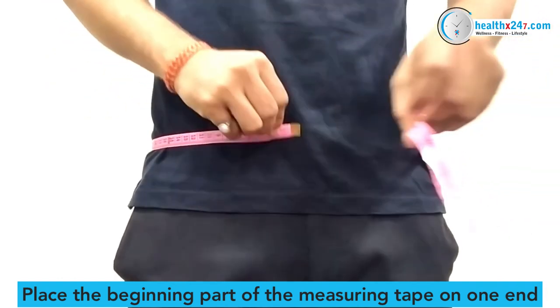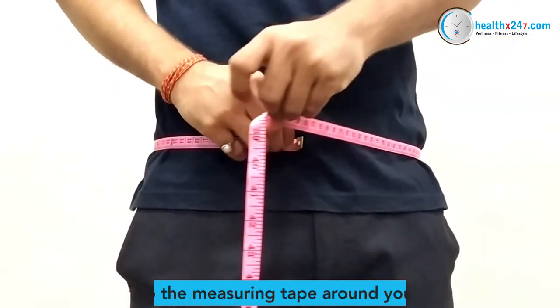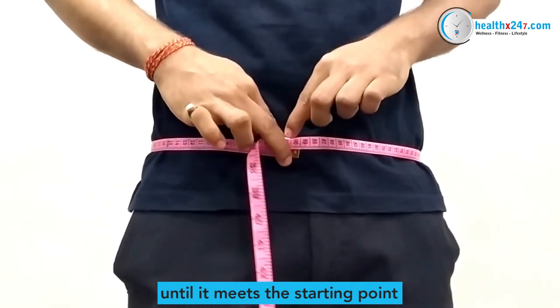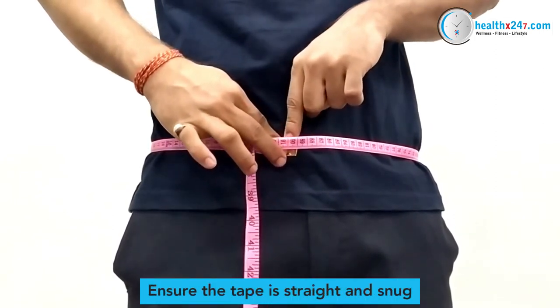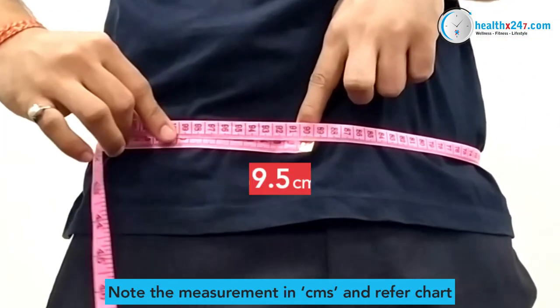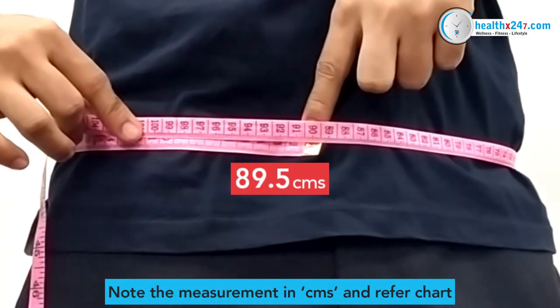Place the beginning part of the measuring tape on one end. Wrap the measuring tape around your hip until it meets the starting point. Ensure the tape is straight and snug. Note the measurement in centimeters and refer to the sizing chart to know the best size for you.